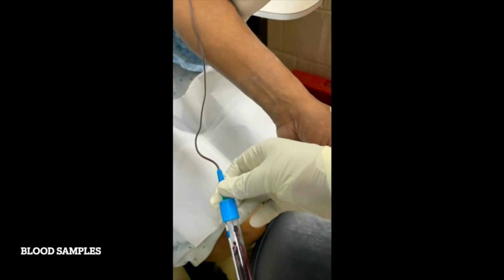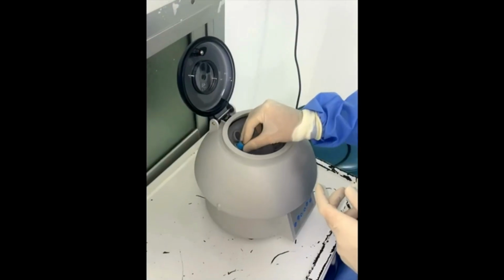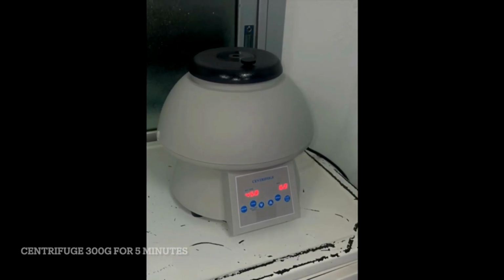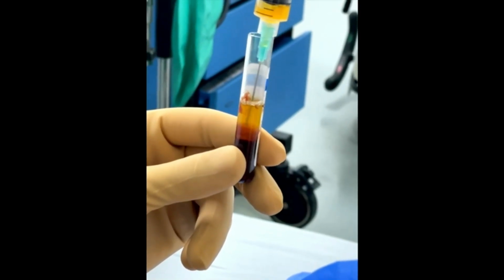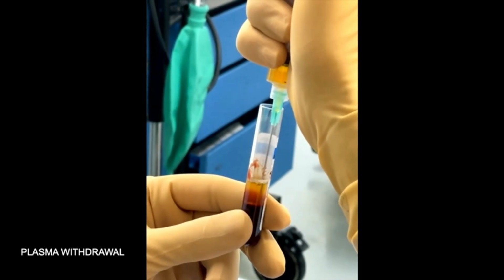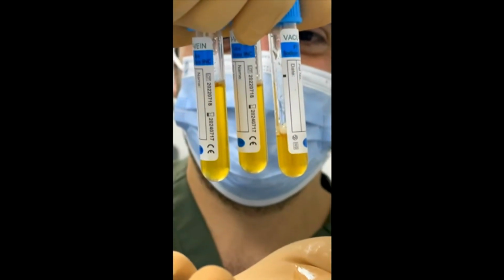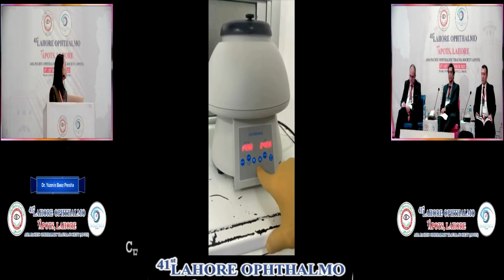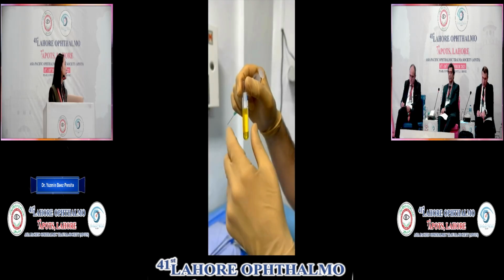How do we prepare it? We centrifuge the plasma twice.